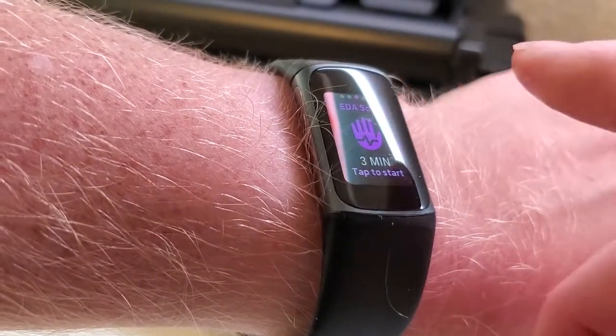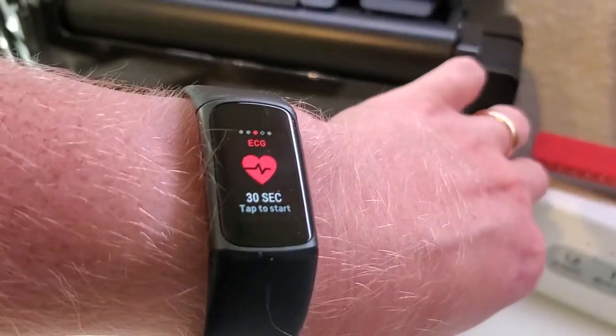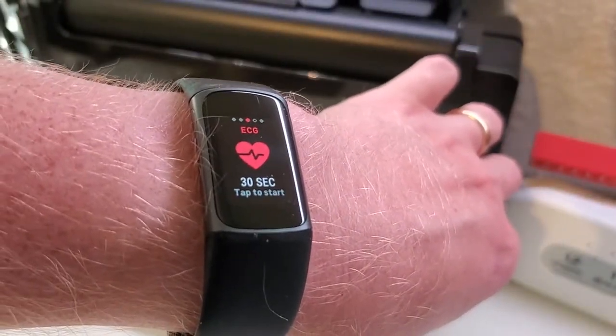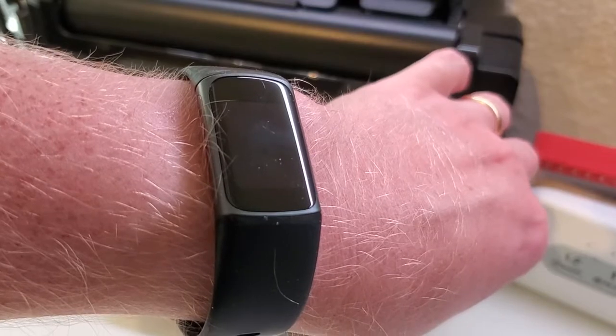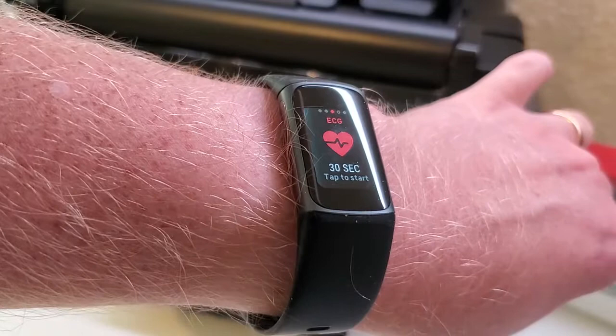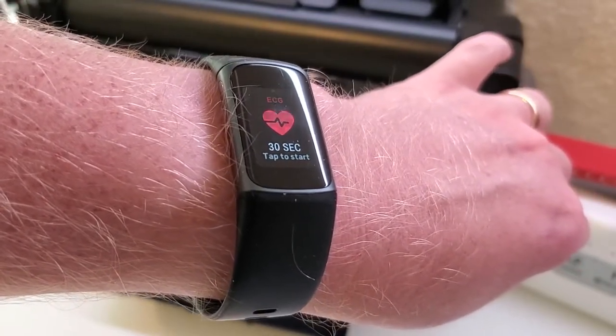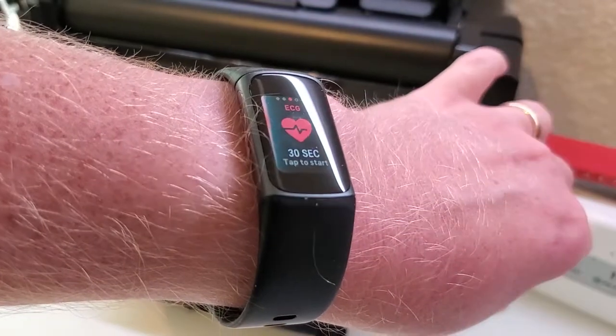Firstly, it's important to note if you have any kind of symptoms that make you concerned about your heart, don't use a watch — go to your doctor and get evaluated. But apparently AFib can be hard to detect, and it can show up without obvious symptoms. So it's nice to have an ECG that's FDA-cleared. Fitbit has really worked hard to get that clearance to actually be able to do that right on your wrist.